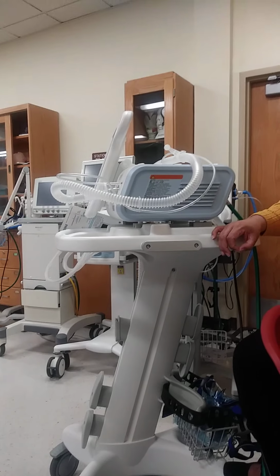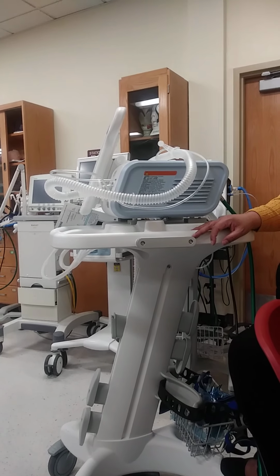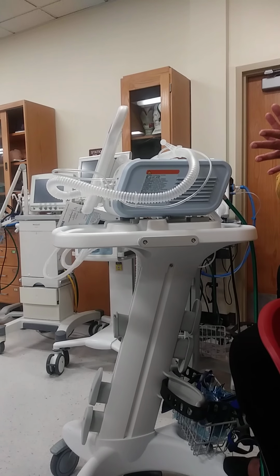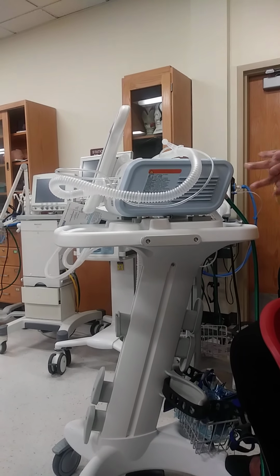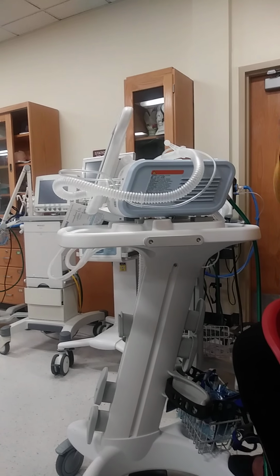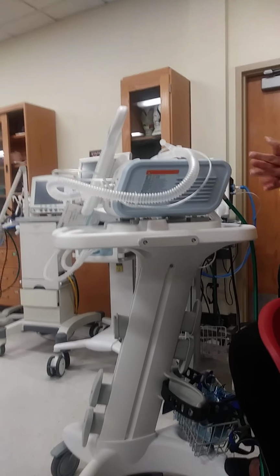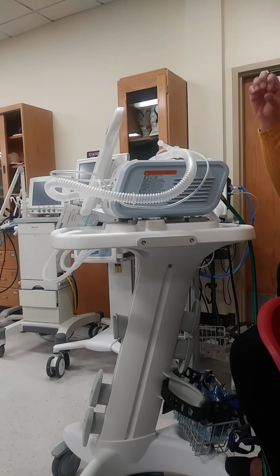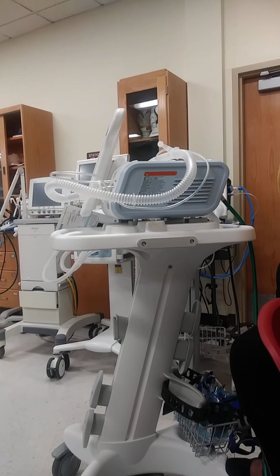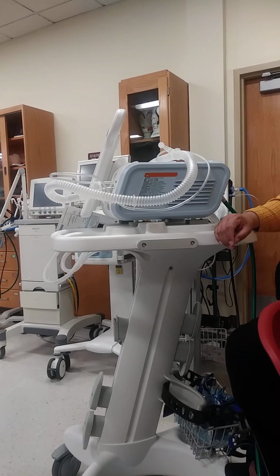While they're asleep, because what usually happens with sleep apnea patients is they fall asleep, and then their trachea collapses, and when it collapses, you stop breathing, right? So we have to do sleep studies on them to figure out what pressure keeps their airways open, and then we set the CPAP on that pressure. Let's say a pressure of 20 keeps their airway nice and stented open, then they no longer stop breathing with that pressure, and their oxygen levels are good.